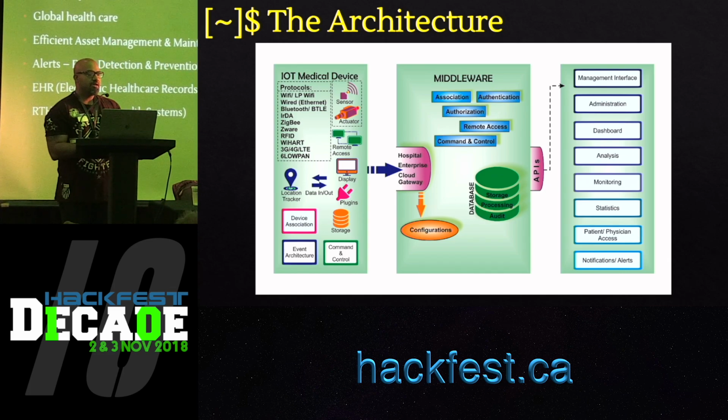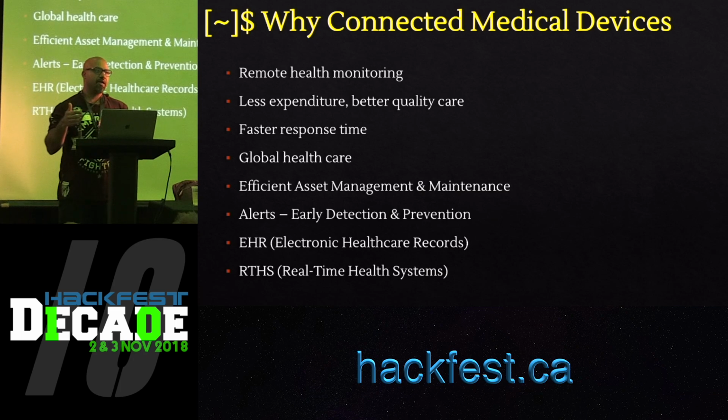So why do we need connected medical devices? There are several reasons behind it. First of all, it allows for remote health monitoring, which means that if you have a connected medical device, you won't have to go for a doctor's visit that often, which cuts down on cost and time. And not just on the patient's part, because medical practitioners are almost always overstressed, it'll also cut down effort on their side. It'll also lead to less expenditure because you don't have to visit the doctor, which might incur a fee. There could be faster response time, so the devices itself may alert you for certain conditions. Doctors may take preventive measures based on your situation.